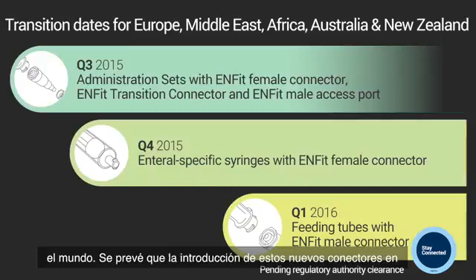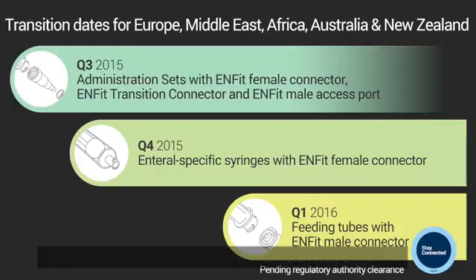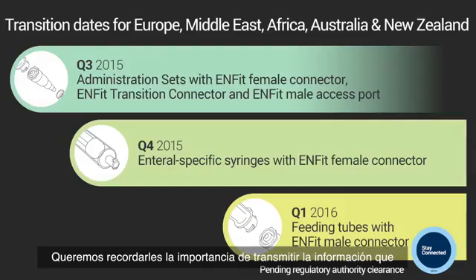Anticipated timing for the introduction of these new connectors in Europe and other markets throughout the world will begin with administration sets in the third quarter of 2015. Enteral-specific syringes will be introduced in the fourth quarter of 2015 and feeding tubes in the first quarter of 2016.